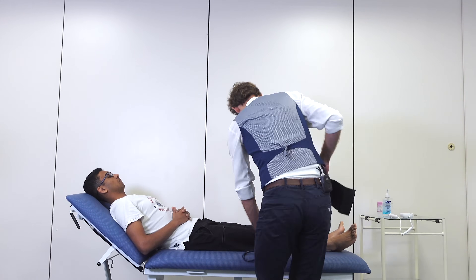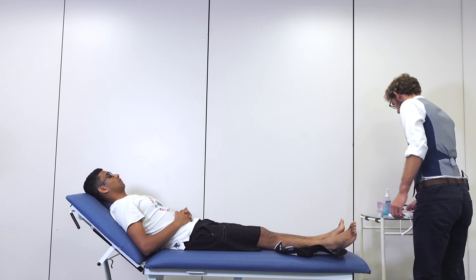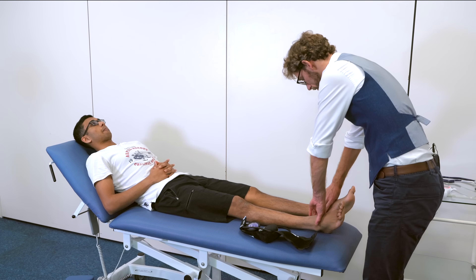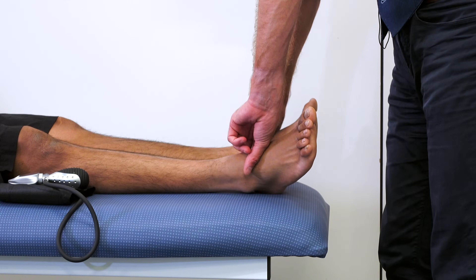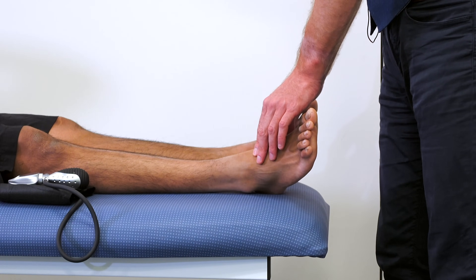So now we need to assess your legs. We're going to disregard the stethoscope now. I'm just going to put my hands on your feet to try and find the pulses there. You've got a good strong pulse at both posterior tibial, and over the front we've got good strong pulses at the dorsalis pedis.